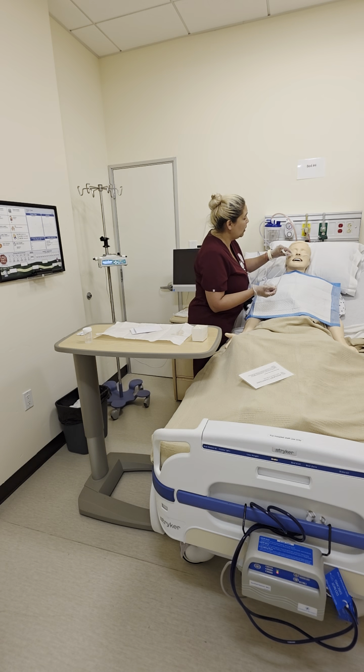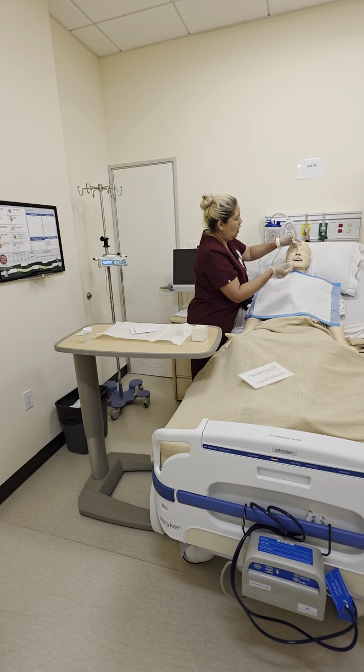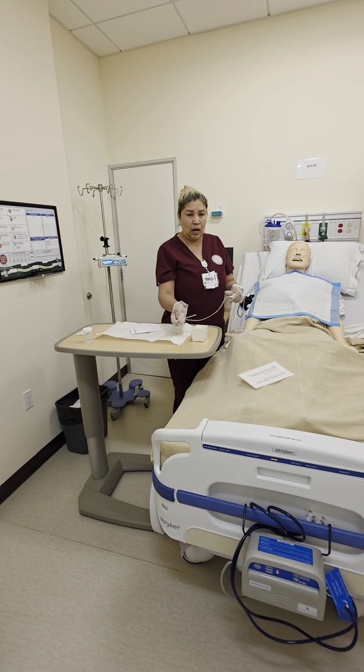Okay, here we go. We're going to go ahead and do it again. Take a deep breath. And I'm going to go to the other nostril. Going in. Okay, no more than 15 seconds. On the way out, pulsating. Oxygenate again. Take a couple deep breaths for me. Okay, he sounds very good now. So now I can determine that all the gunk has been removed.